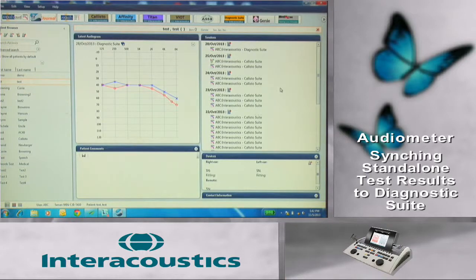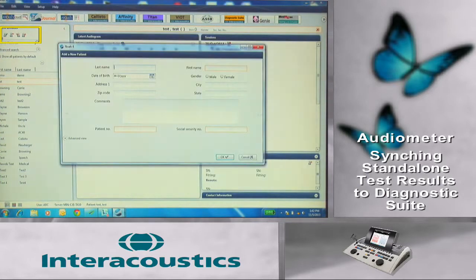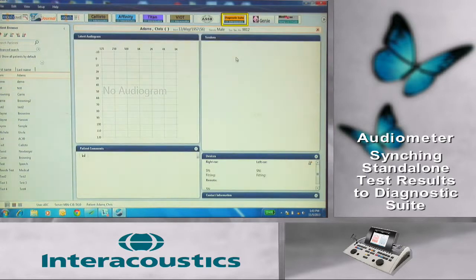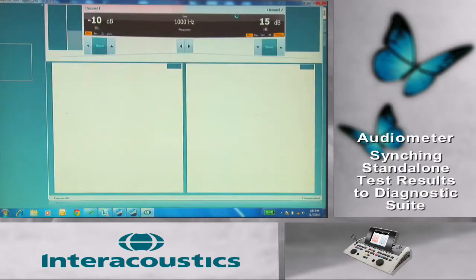To begin transferring the client data, enter the client into the preferred database. This can either be Noah or OtoAccess. Once that patient is entered and Diagnostic Suite is opened and viewable on the computer screen, simply complete the test on the audiometer in the normal, stand-alone operation.